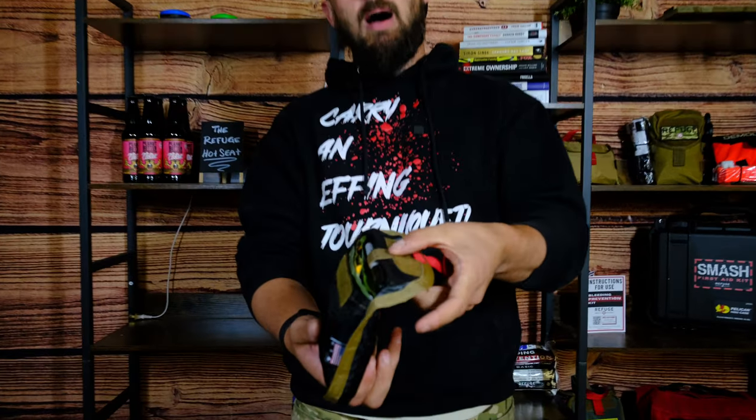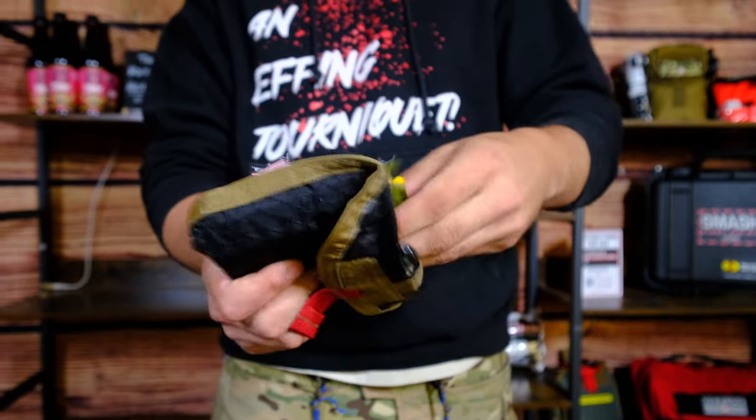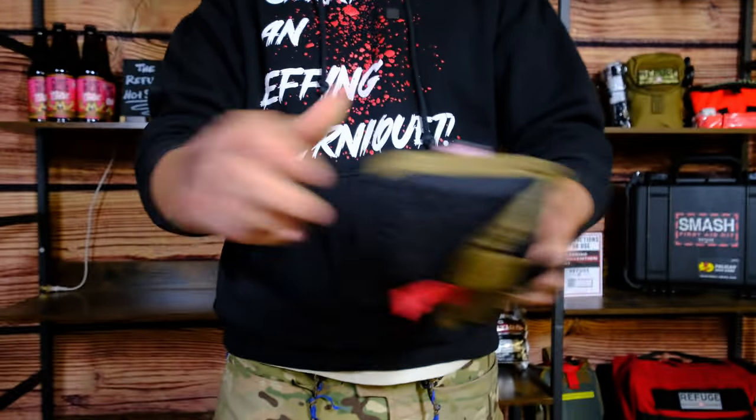Inside you have a really sleek diamond black pocket, and once you look inside this pocket you'll see at the very top you have a sharpie. You also have the option for a decompression needle if you were trained in such things.